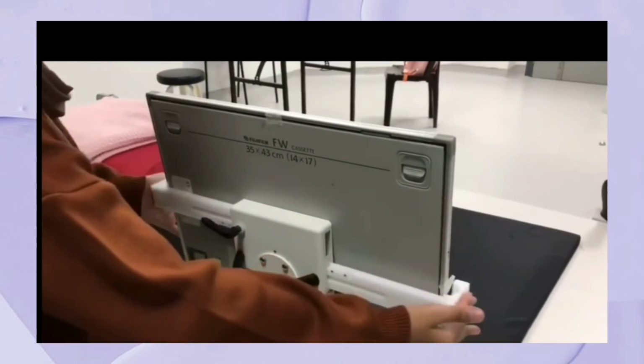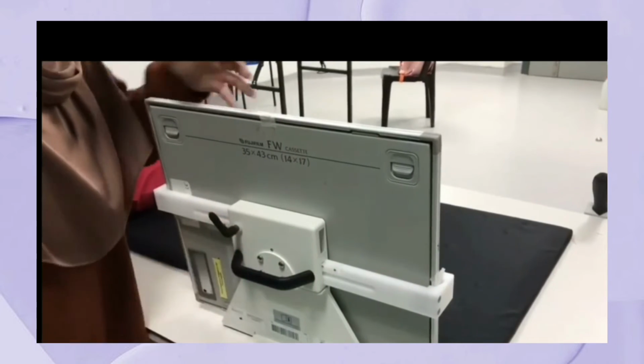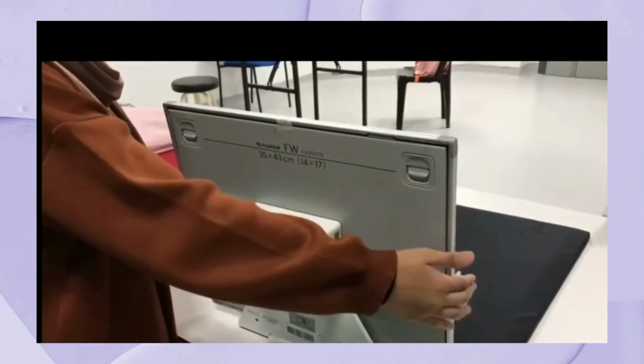Okay. So we will tighten it like this, and then so the tube can stay. Okay.